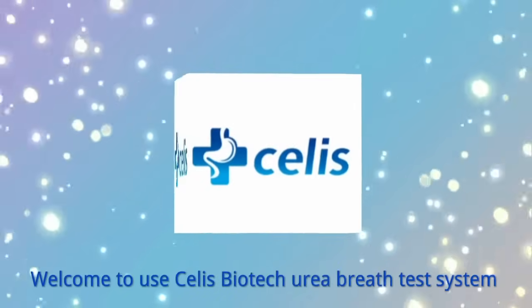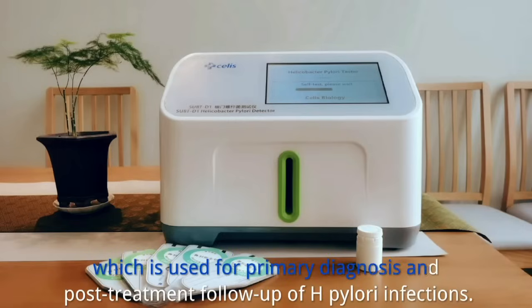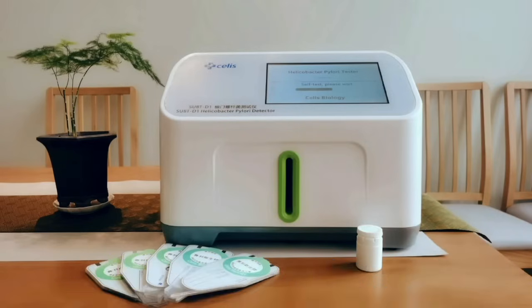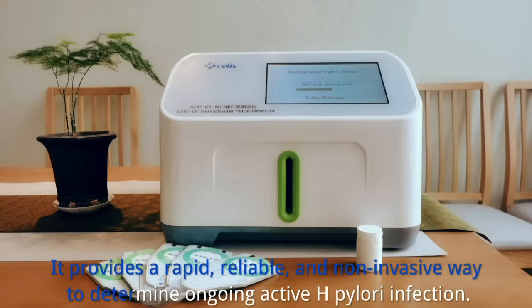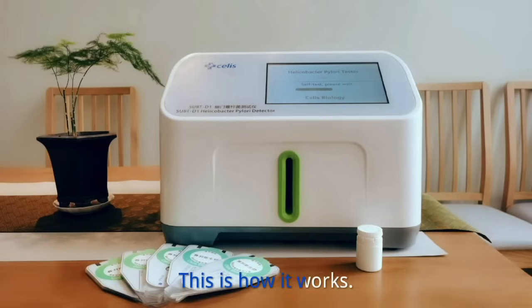Welcome to the Celis Biotech Urea Breath Test system, which is used for primary diagnosis and post-treatment follow-up of H. pylori infections. It provides a rapid, reliable, and non-invasive way to determine ongoing active H. pylori infection. This is how it works.